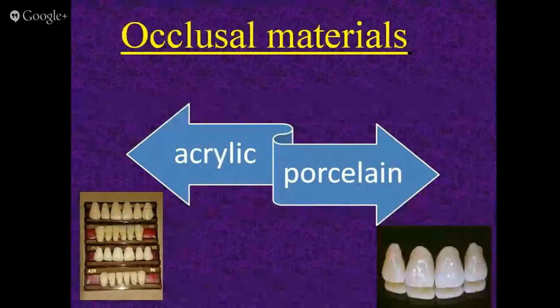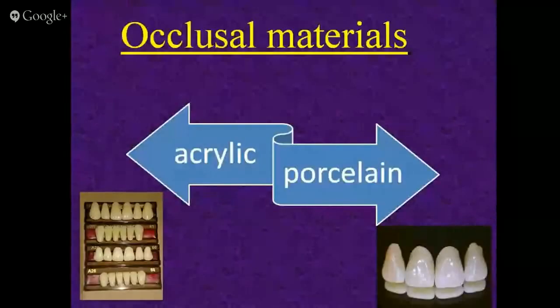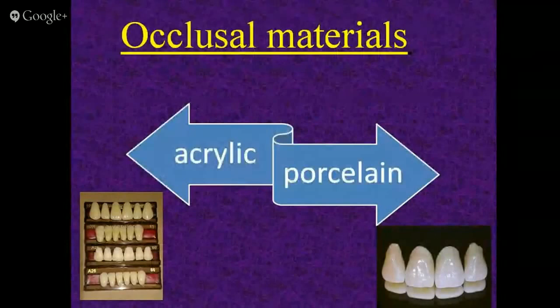Coming to the occlusal materials to use, we have acrylic, we have porcelain. If patient can afford, go for porcelain. If patient can't afford, go for acrylic. Is this how we decide the occlusal material? Definitely not. We have to take so many factors into account.